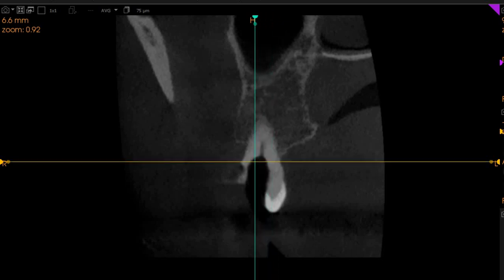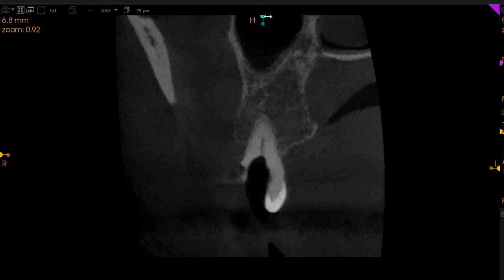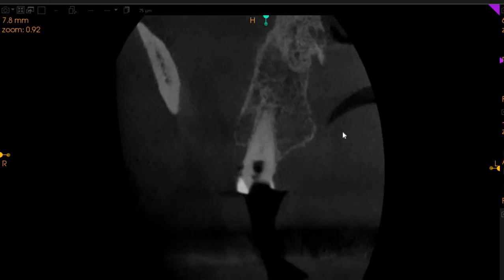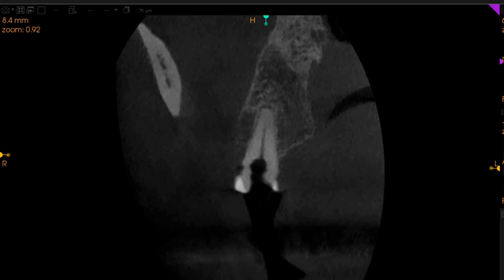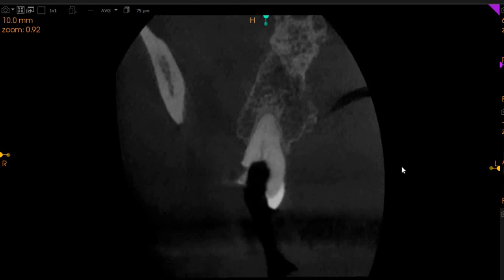This is the mesio-buccal canal, as you can very clearly see here. And then we've got the very nice disto-buccal canal right here. If you have any further questions, please feel free to reach out to our team. Thank you very much.